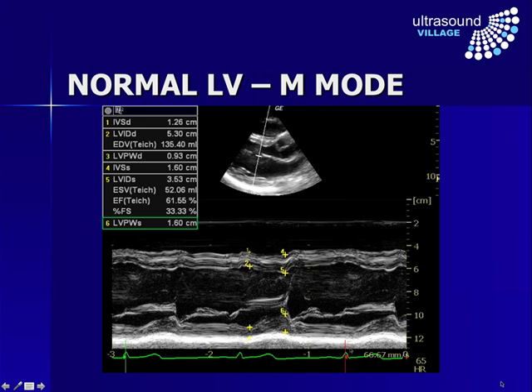If we want more precise measurements, we can look at that in M-mode. I don't recommend this, because although it may be more precise, it's not necessarily going to be more accurate — if your angle is wrong and you're not perpendicular to the long axis of the cavity, you won't be getting an accurate measurement. Nevertheless, if we look here, we can see the diastolic diameter and the systolic diameter, and that gives us a fractional shortening of 33%. There is a slightly more complicated formula than the simple doubling, and that gives us an estimated ejection fraction of 61%.